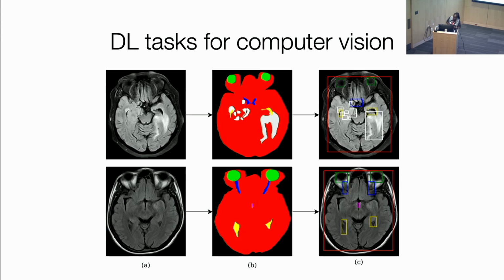Now, I will say that if you've heard of an algorithm from Meta called SAM, which is for segmentation, people have tried to build segmentation models. If you go to the MICCAI website and look at the workshops and the competitions, you can see some of the data sets and the challenges, like a total body segmenter. Now, for people working in very small spaces like the throat, those are very finite things to draw, and those tend to be very challenging. In our own work, we've tried this for body composition, which just means you're looking at the distribution of fat and muscle, and there are quite a lot of papers published on that. Frank found it very difficult to reproduce them, which was a little bit surprising to me because there's quite a lot of work being published on this, but just segmenting muscle versus something else remains a task. So there is an opportunity for automatic segmentation.